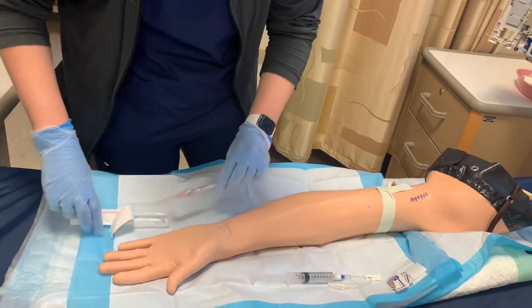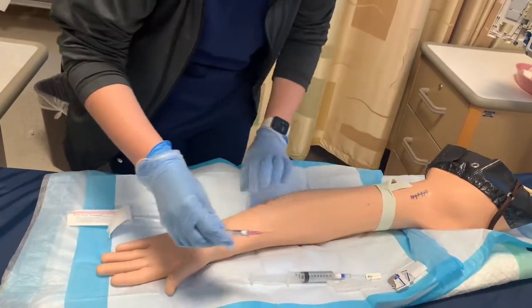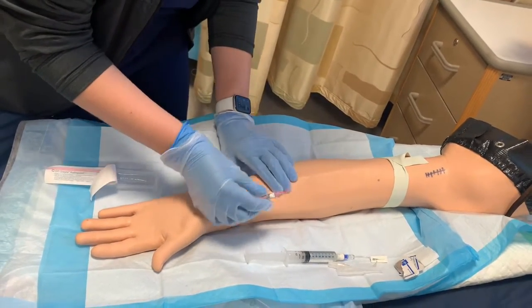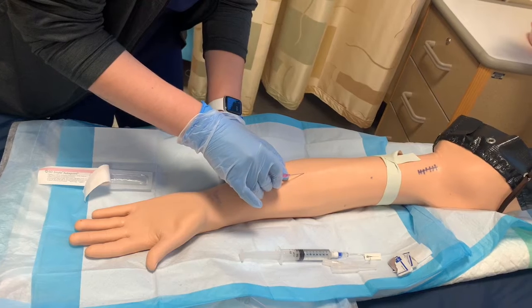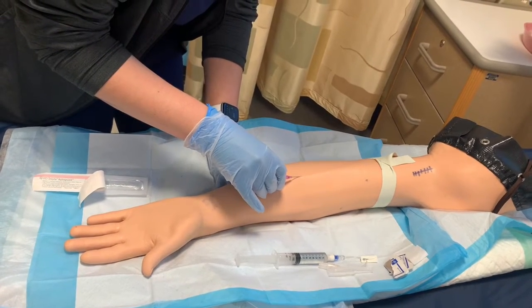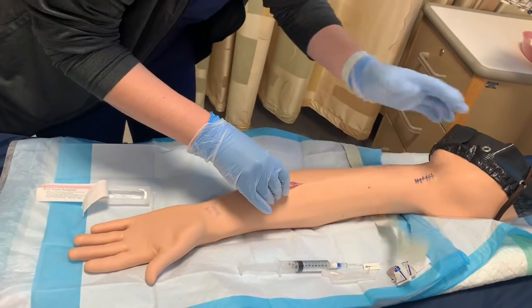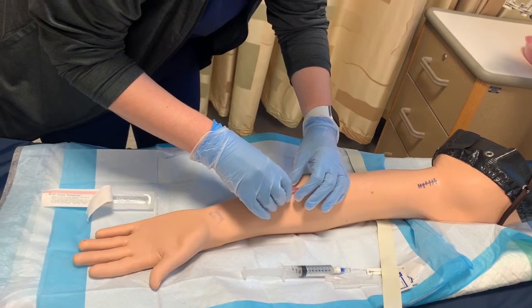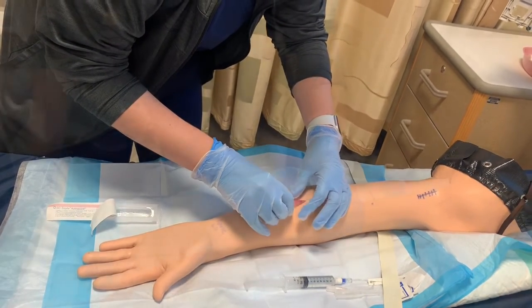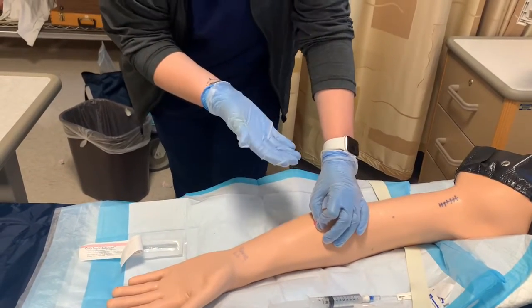Okay, Ms. Jones, you're going to feel me pinch. Just going to be inserting your IV now, okay? Try to stay nice and still. Place my hand underneath the vein I'm going for at a 15 to 30 degree angle. Good. I got a flash, remove the tourniquet. Lower it down to the level of the skin and advance the cannula. Okay, so I got the catheter placed. I'm still holding on to it.